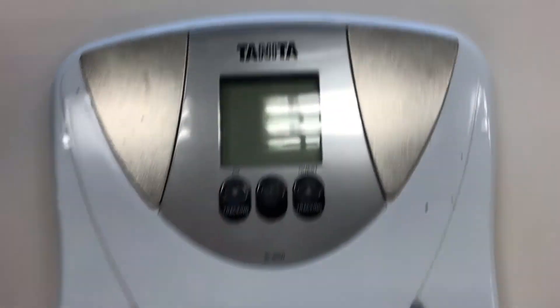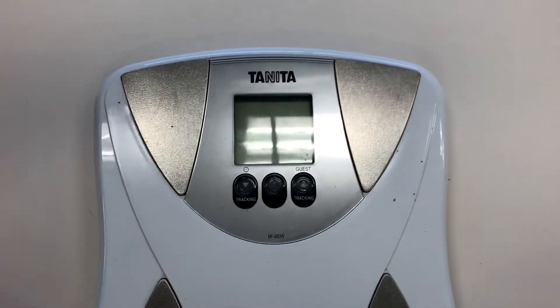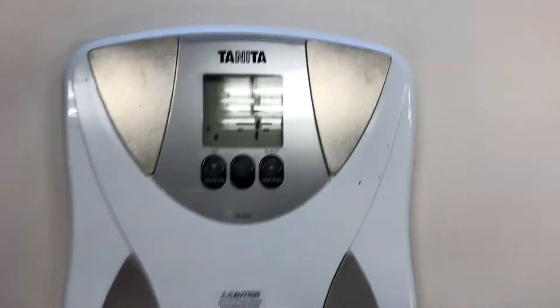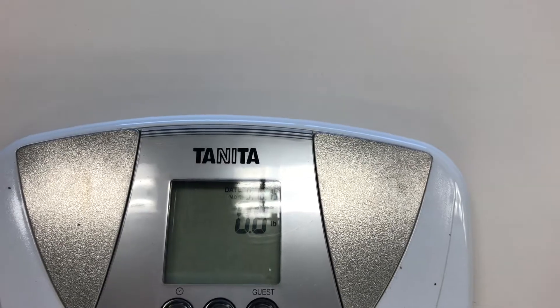If the machine doesn't shut off by itself, you're going to press the off button at the bottom. Then when you're ready to actually use the system, you're going to press one, two, three, or four — however you programmed it — and you'll notice that your information is located there and it's ready for you to stand on.